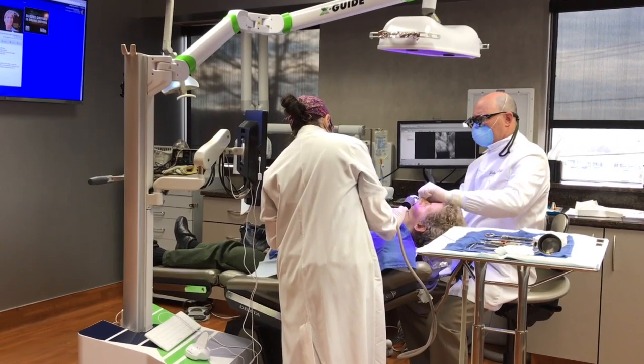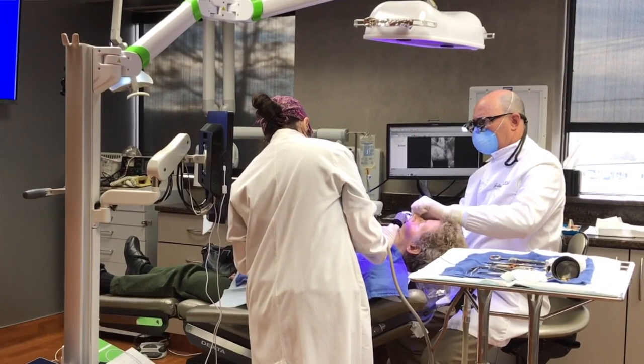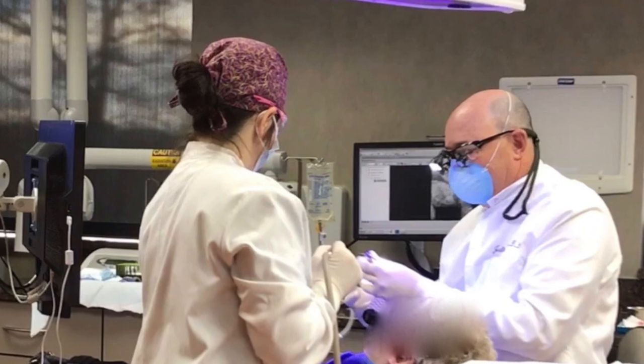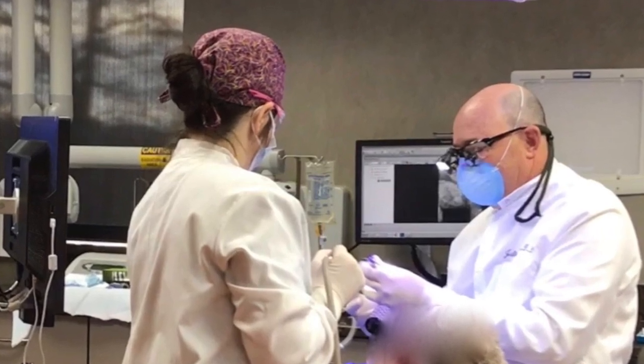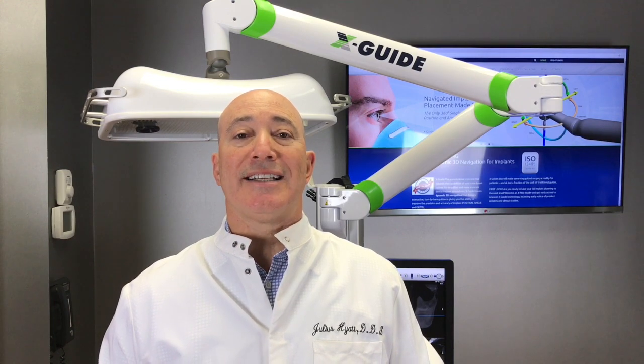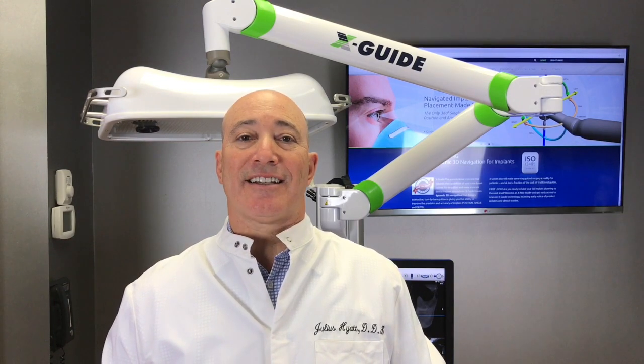Once the implant goes in, generally you need a healing time of approximately two months for the implant to osseointegrate. We check it one more time, then you go to your dentist to get your restorations done. All of our surgeons here at the Maryland Center for Oral Surgery and Dental Implants are trained in this technology.